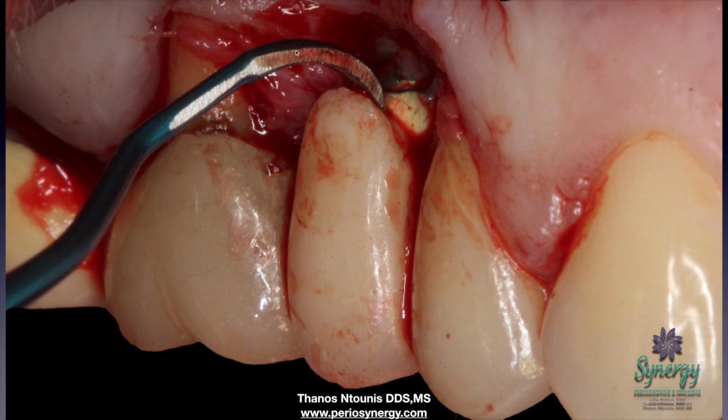So obviously the issue here is the design of the restoration. A very simple bailout would be, after of course consenting the patient, that I would like to touch this crown up. I would like to change the shape of that crown, especially in that subgingival portion of the crown. Obtain consent, and make sure the patient understands that this may jeopardize the entire prosthesis. Of course, that is not as difficult as it sounds, especially if the patient understands that it's the crown that's the main culprit of the situation we're dealing with right now. And I use a high speed and a diamond.